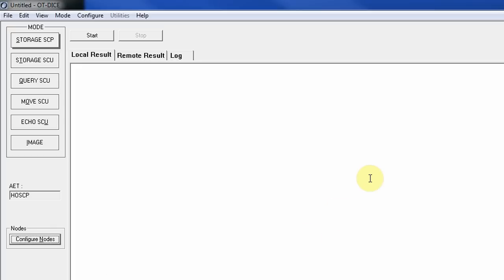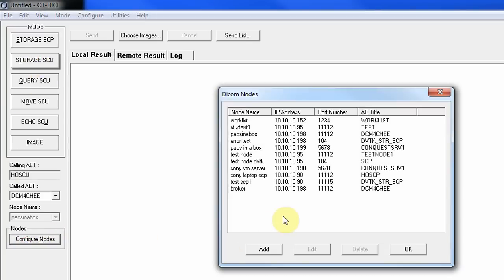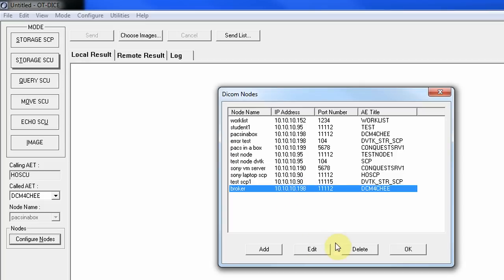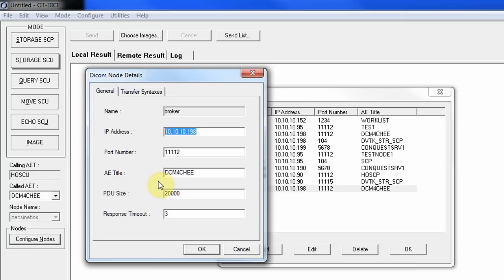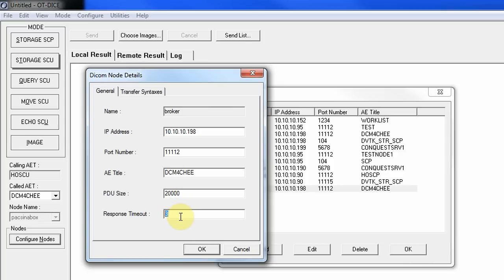We've configured the SCU and SCP details. Now we need to configure the SCU nodes — the destinations. For the Worklist Provider, I call it the broker, with a unique IP address and port 11112. We set the AE title for that device, the PDU size of 20,000, and an application-level timeout of three seconds before it issues a timeout message.